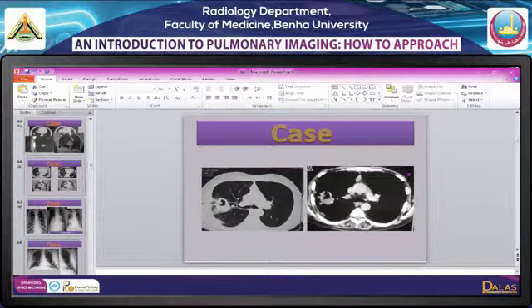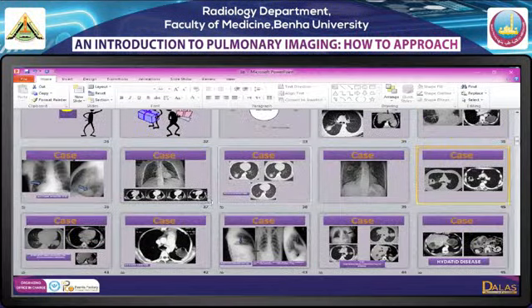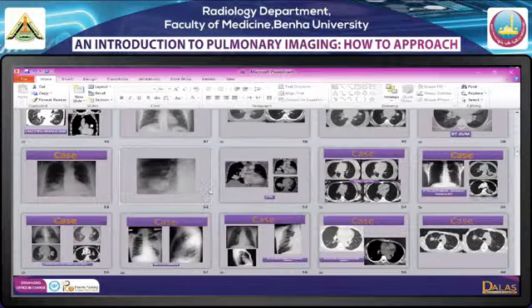هو اللي انا قلته ده بالظبط هو الدايجنوستيك فيتشر بتاع الكابوزي. بس اهم حاجه في الكابوزي ان حضرتك تكونسيدر في الدايجنوز من الاول، يعني لازم ابقى في منطقة انديميك او عيان اميون كومبرومايزد ماركلي، عنده ايدز وات ايفر.